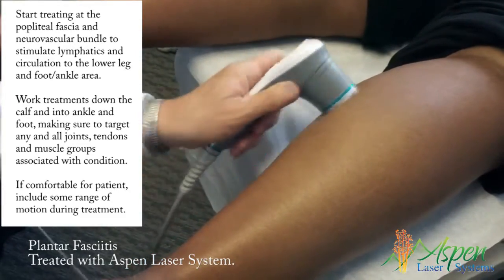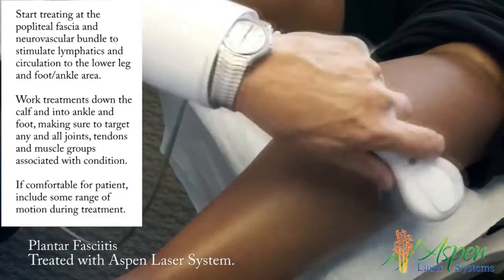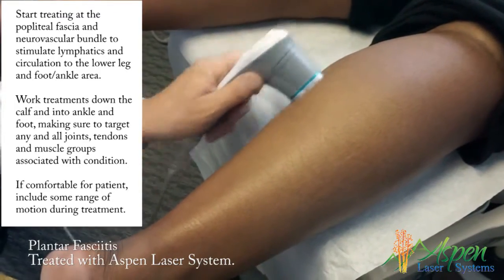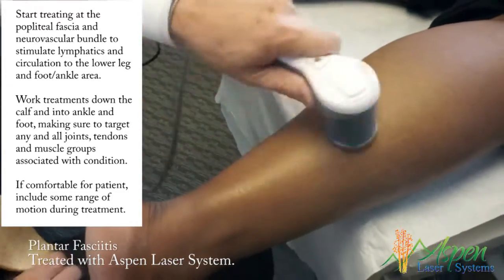Cells need ATP as an energy source for any type of biochemical healing. It also will block pain. This is good for water absorption and hemoglobin absorption, so she should get a lot of relief. I'll do the heads of the gastrocnemius.